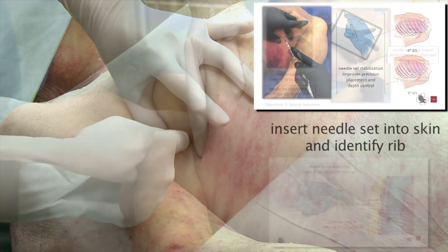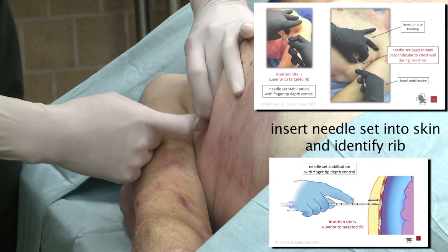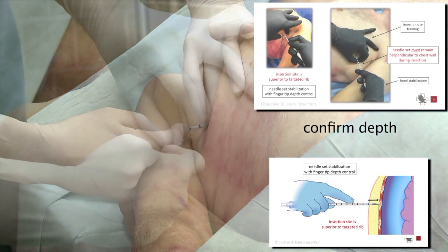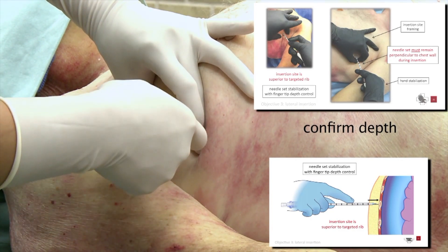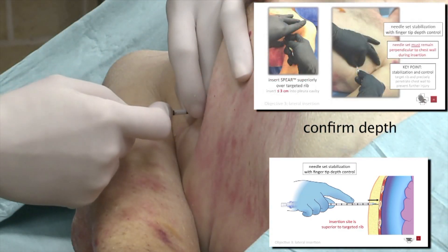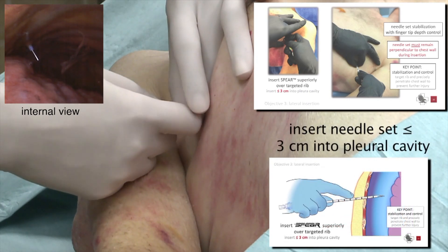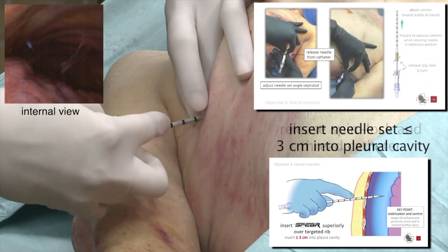Insert needle set into skin and identify rib. Confirm depth. Insert needle set less than or equal to three centimeters into pleural cavity.